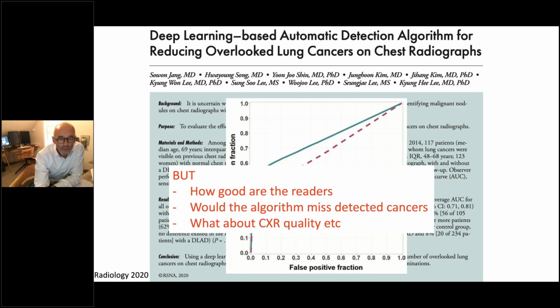We know that in the study looking at multiparametric MRI, the readers had to do an evaluation test before they were included in the study. And in the study I organized myself using a new tracer for prostate cancer, all the readers had to be trained, then they had to do an evaluation test, and if they didn't pass it, they were not allowed to partake in the study. So we set a threshold for how good they are. Is that included in all the papers that you read?